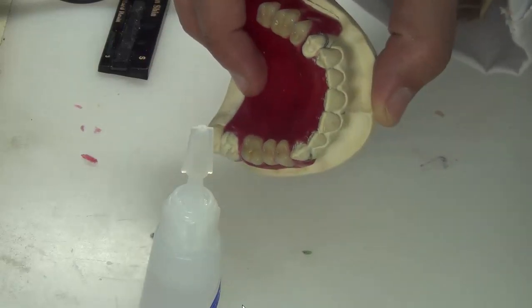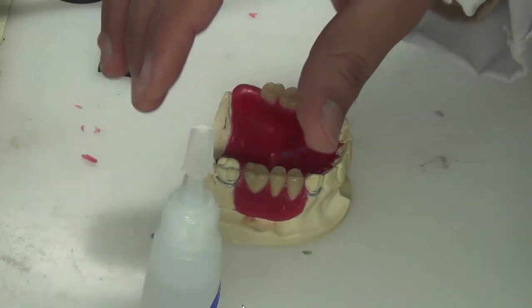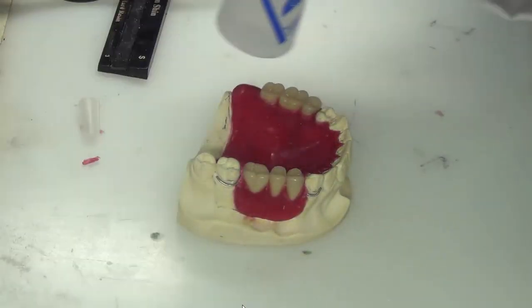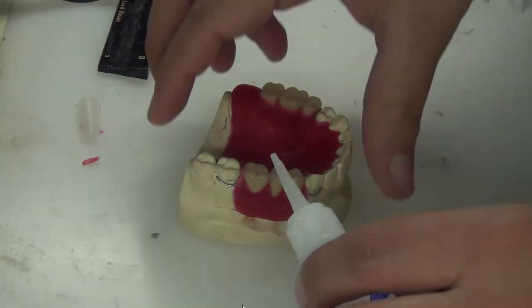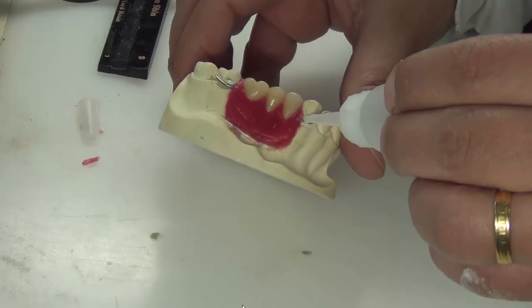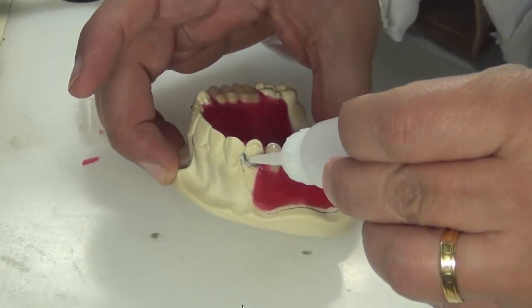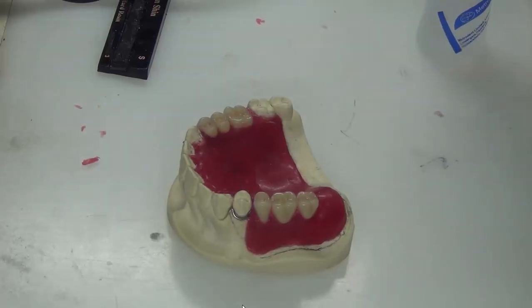Now also these wires can change in location while working, so we need to fix them by a drop of super glue. So you're going to go to the clasps and put a drop of super glue on them. This will make sure that the clasps stay in place while we're working with them.